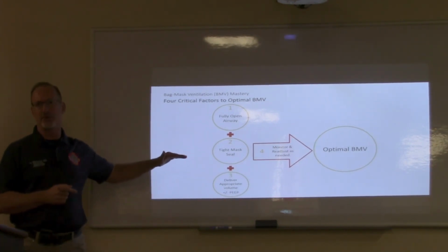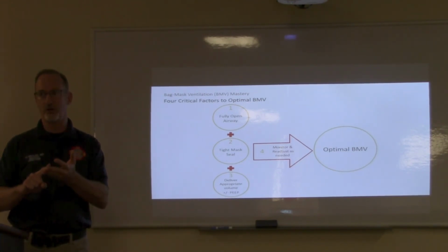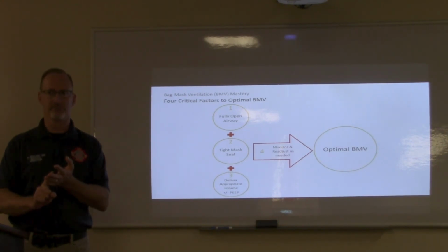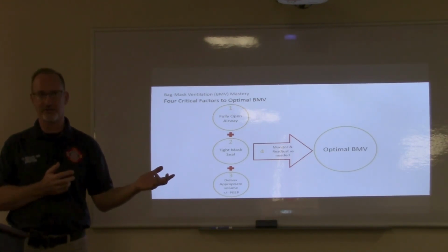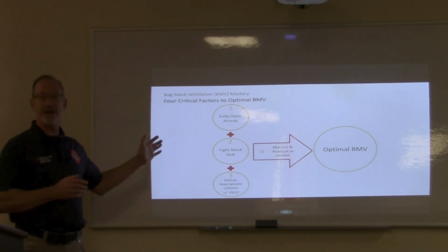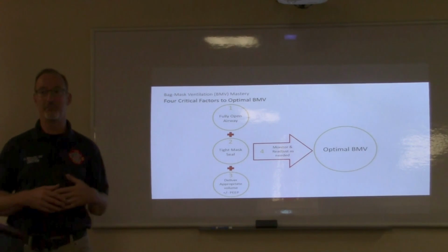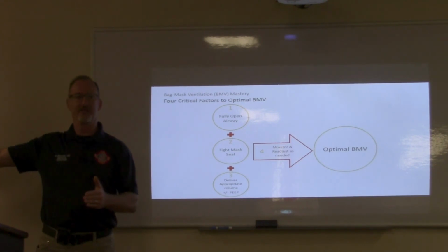There aren't too many people that have to get an LMA or an ET tube or a crike in the pre-hospital setting that go on to have a good outcome. Let's just be honest. If you need one of those things in the field, you're having a really bad day. The chances of a good outcome are, from the get-go, pretty small. But there's a lot of people that get bagged that can have a good outcome. The patients who have cardiac arrest that have the best outcome are the people that we convert before they ever get to an invasive device.